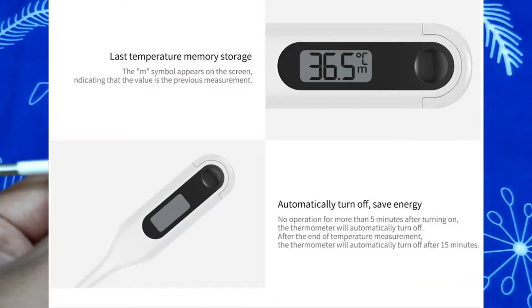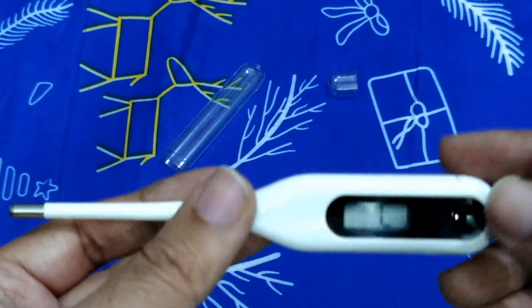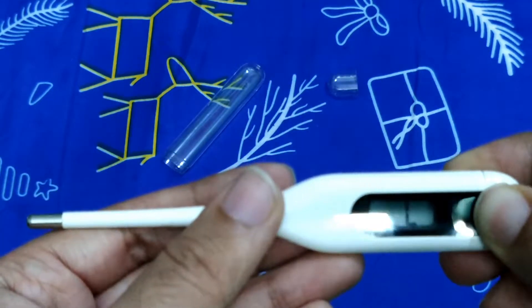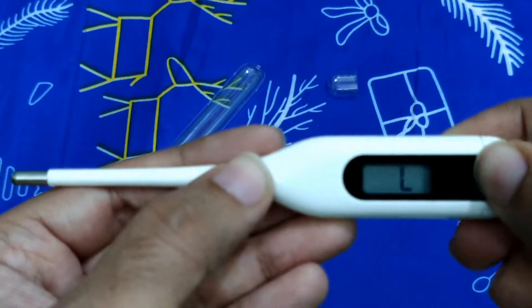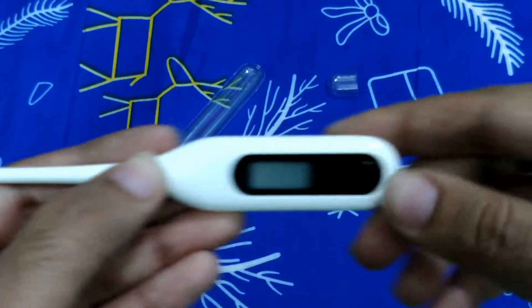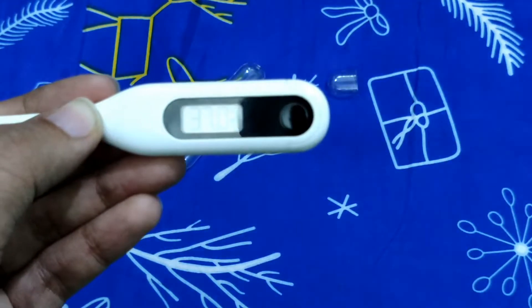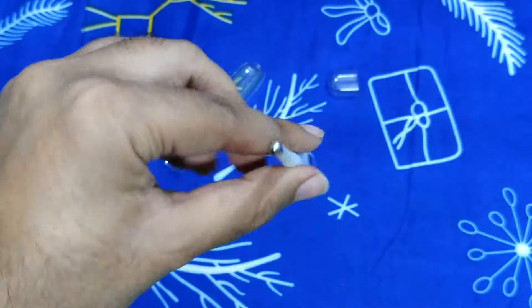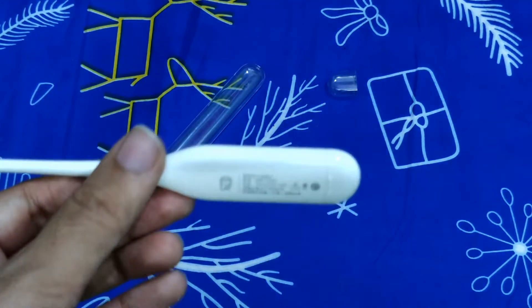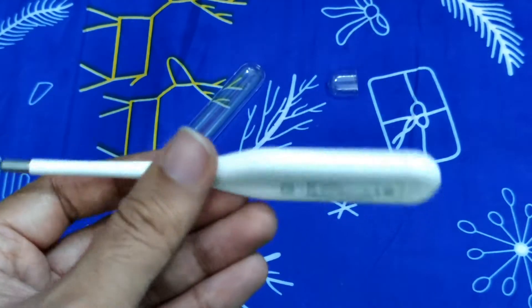This thermometer also has the capability to record your previous reading. As you can see, if I turn it off for a few seconds and then turn it back on, you can see an 'M' reading showing 37 degrees Celsius — that is the last recorded temperature it stores. That's a cool feature.